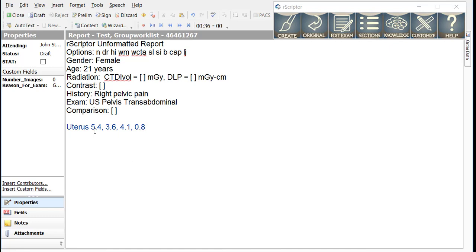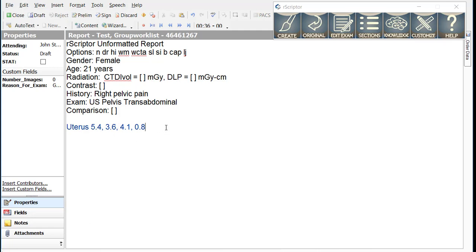In this case, I'm dictating the dimensions of the uterus in centimeters and the dimensions of the endometrial stripe. Again, we do not put punctuation on the end of the sentence and we typically separate numbers with commas in the smart macros. Next.